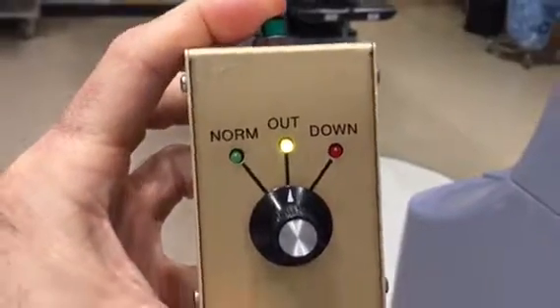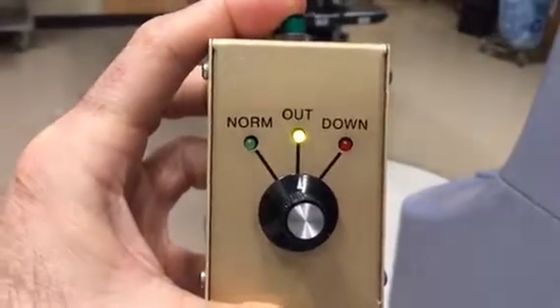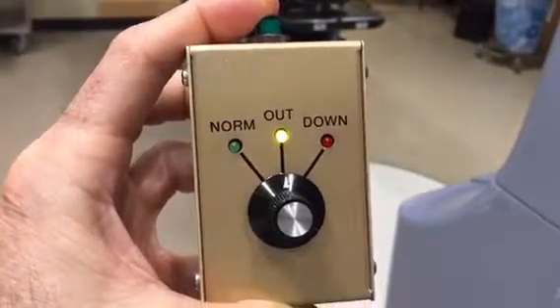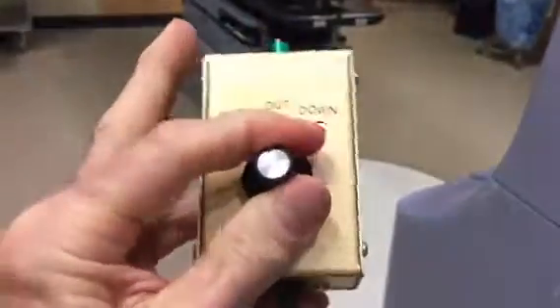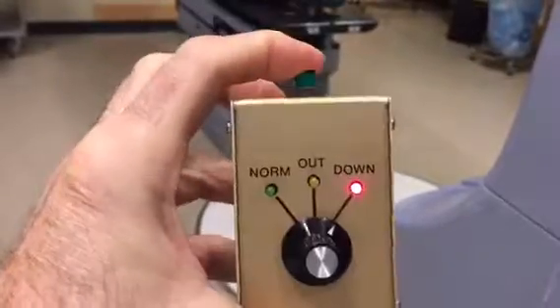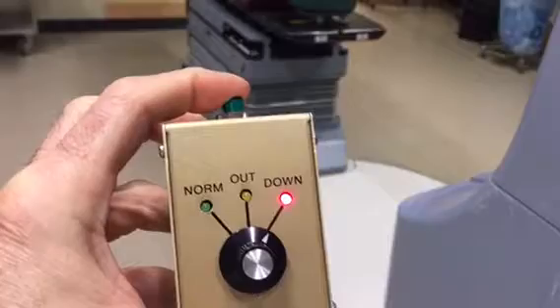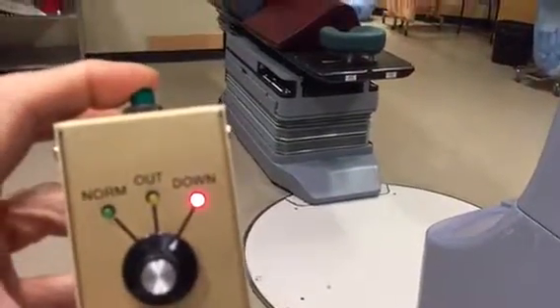You can now control the longitudinal top of the coach. Pull it out of the way with the patient on it or whatever. Switch it to down and press the green button — the coach will go down. Do not take the coach all the way to the bottom or you will destroy the coach.